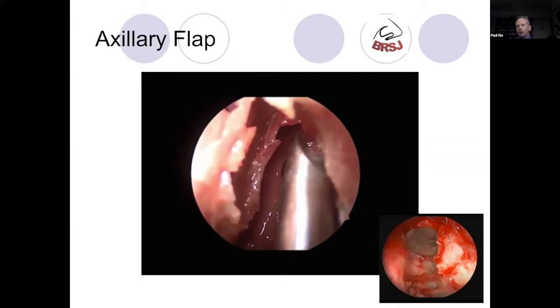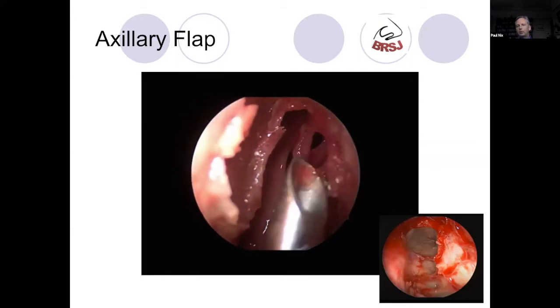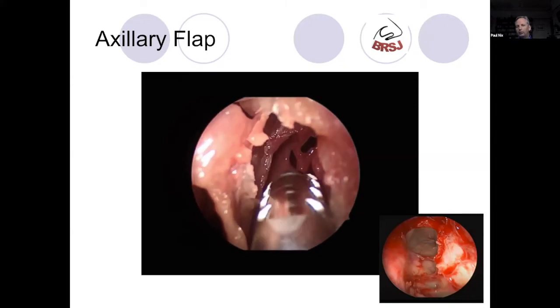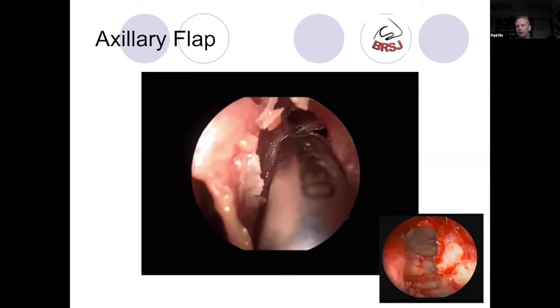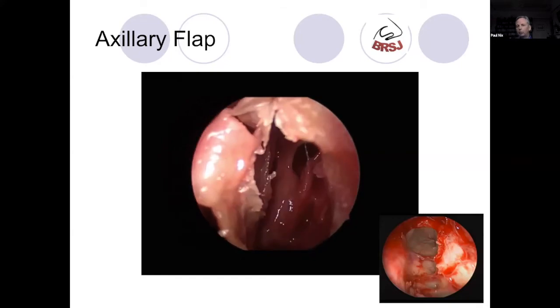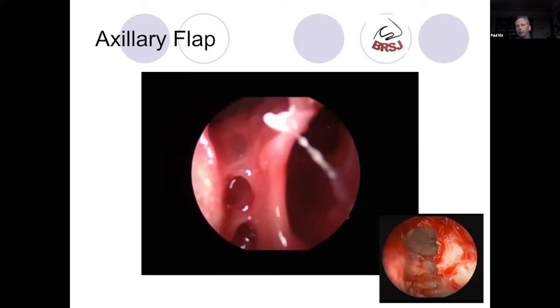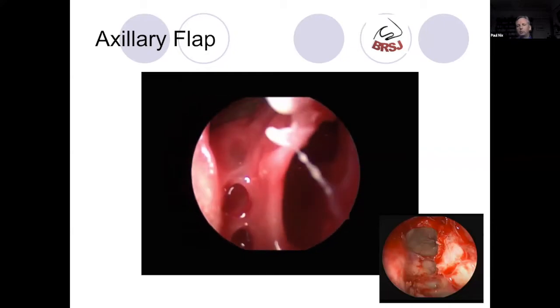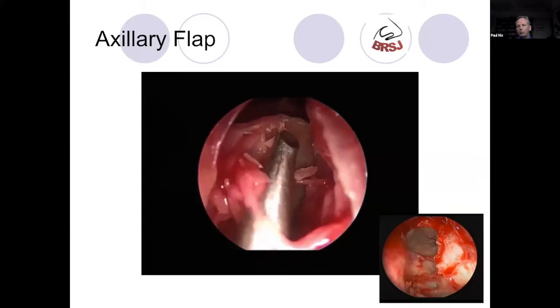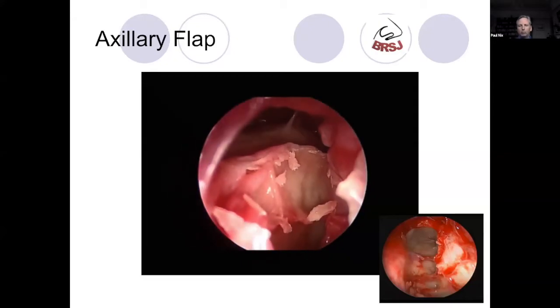And I think the important point in this frontal recess now is not to grab mucosa and rip it out. It's really precision cutting of any cells and using through-cutters or a microdebrider to remove precise bits of mucosa, preserving as much mucosa around that outflow tract as possible. You can then fracture cells to improve access into that frontal sinus.